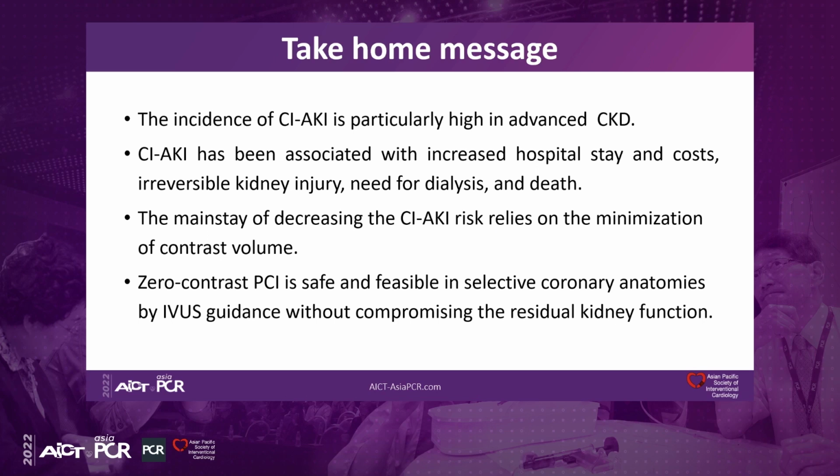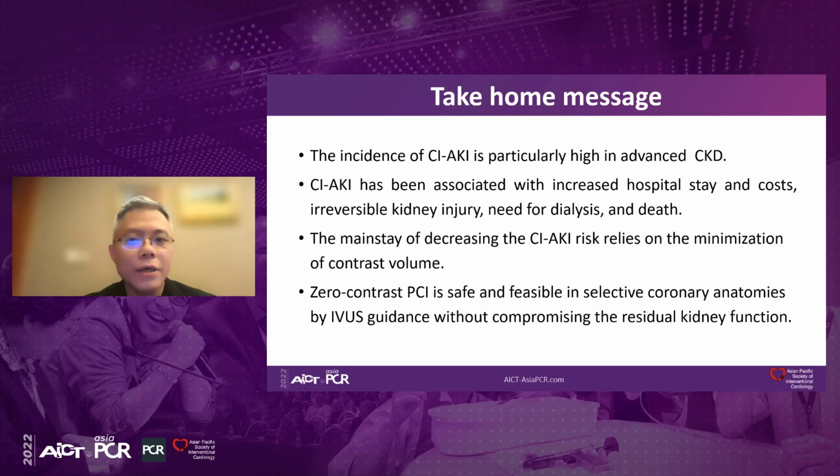So let's have a take-home message. The incidence of contrast-induced AKI is particularly high in advanced CKD. CI-AKI has been associated with increased hospital stay and costs, irreversible kidney injury needing dialysis, and death. The mainstay of decreasing CI-AKI risk relies on minimization of contrast volumes. Zero contrast PCI is safe and feasible in selective coronary anatomies by IVUS guidance without compromising the residual kidney function. Thanks for your attention.